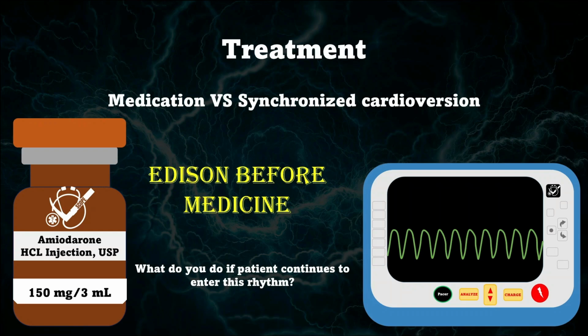I'm a huge advocate for sedating patients in many scenarios, but if the patient is this sick, I would suggest that you don't give a benzodiazepine such as Versed prior to cardioversion, as you don't want to tank their blood pressure more and cause them to go into cardiac arrest. However, I will say that synchronized cardioverting a patient is not a fun experience. It is very painful for the patient, so you might need to give some medications afterwards to help deal with that pain.